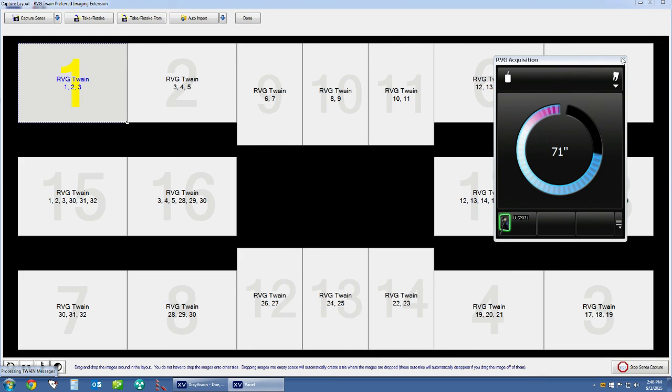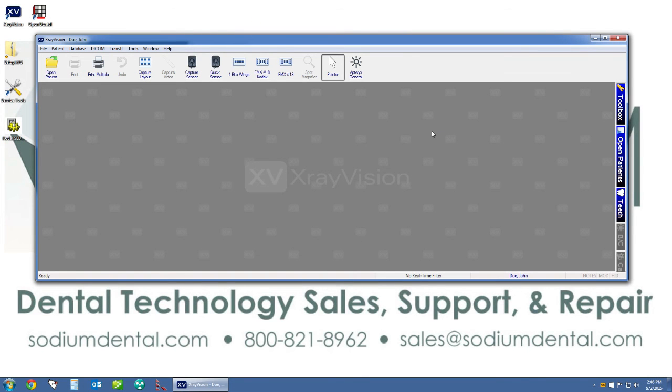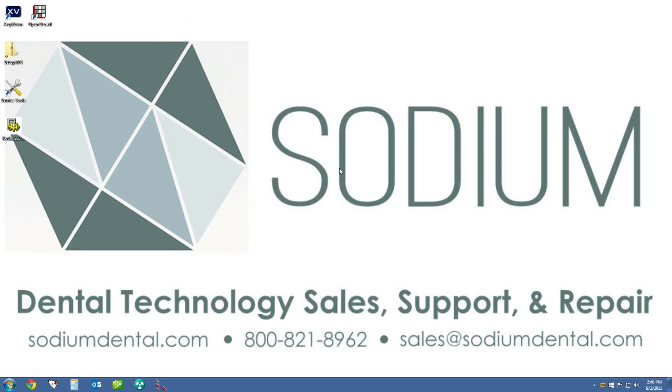Once complete with testing, click the X in the RVG acquisition window to close out of the sensor, click quit, then click done. We have now installed the Kodak RVG 6100 sensor into Windows, integrated it into the X-Ray Vision imaging software, set up our custom Kodak-compatible image layout for X-Ray Vision, and tested to confirm that the Kodak RVG 6100 sensor works correctly in our X-Ray Vision software.